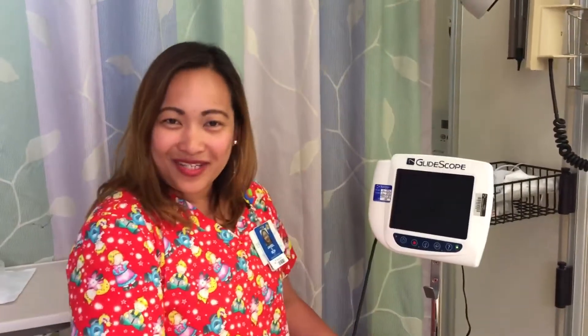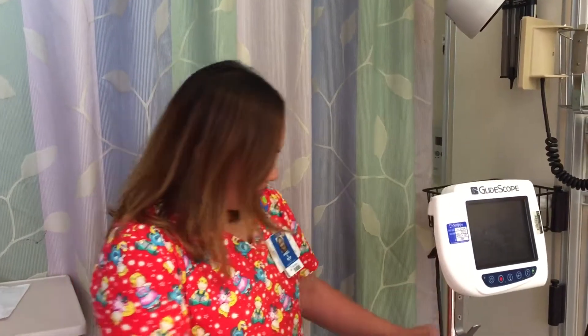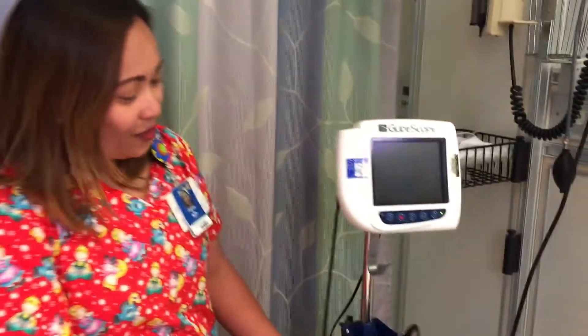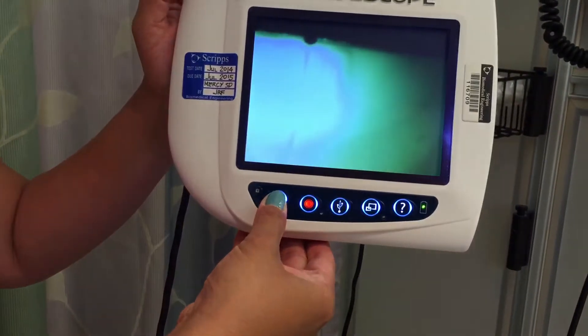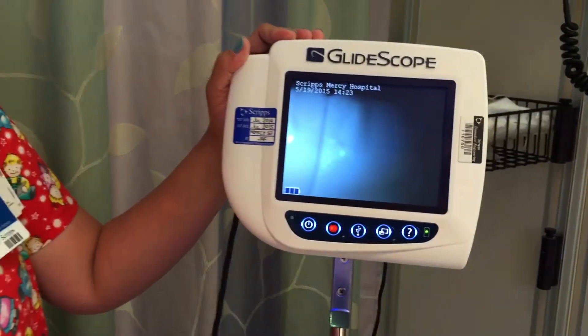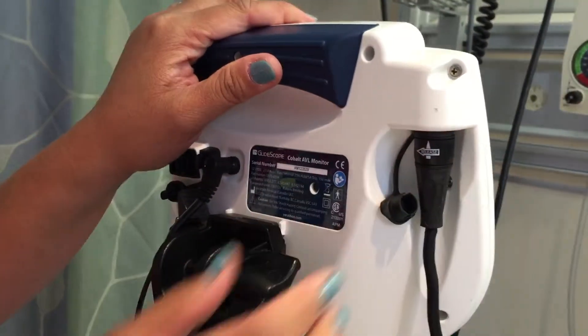Now we have to grab a clean GlideScope. We have to make sure that the GlideScope plug is always plugged in at all times so that it will be fully charged and ready for emergency. Now turn on your GlideScope using the on/off button — press and hold until you see the picture. You have to make sure that we will have a picture here to confirm the video is working. If not, then we can check the knob on the back to make sure it's tight and intact.